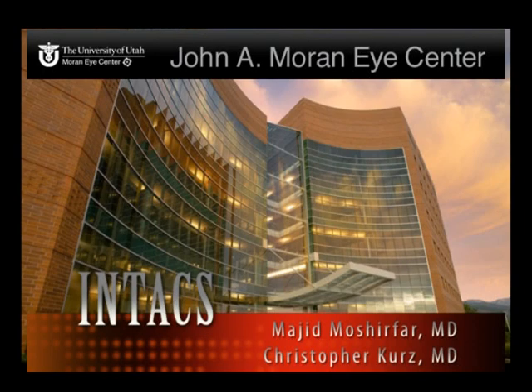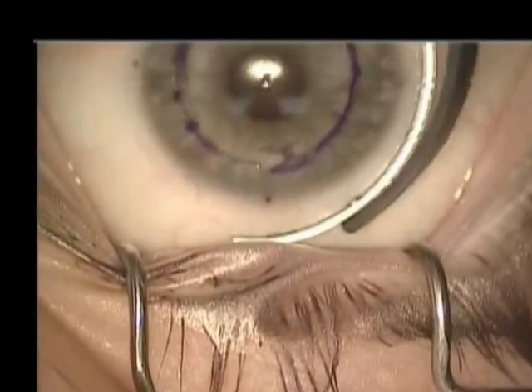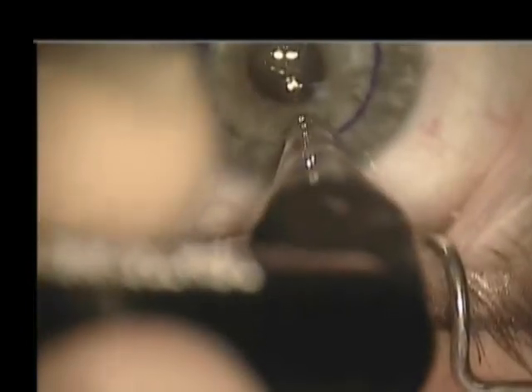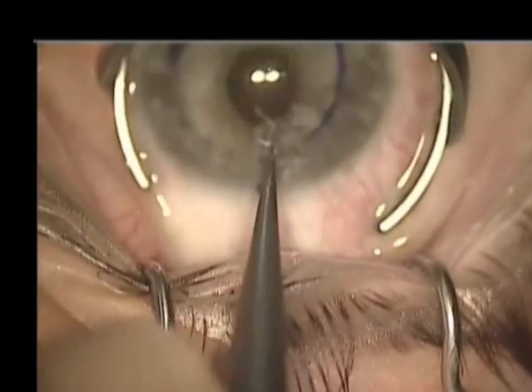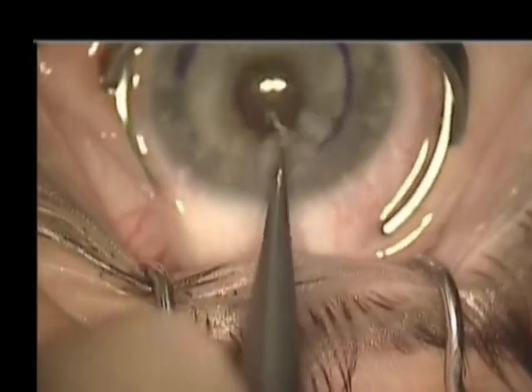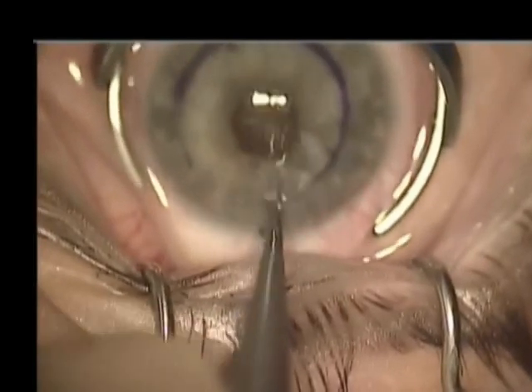This is a case of INTACS implantation. The center of the cornea is marked, the guide is inked and placed on the central marking, peripheral pachymetry is performed, and the incision is made at approximately 70% of the pachymetry.